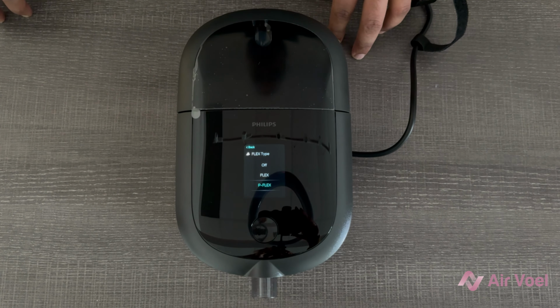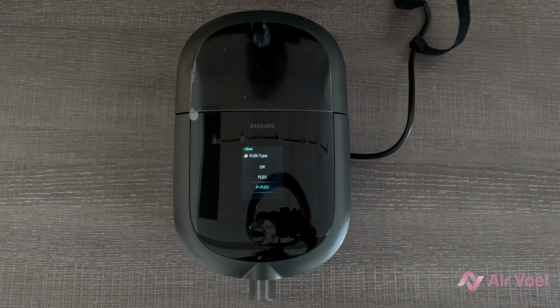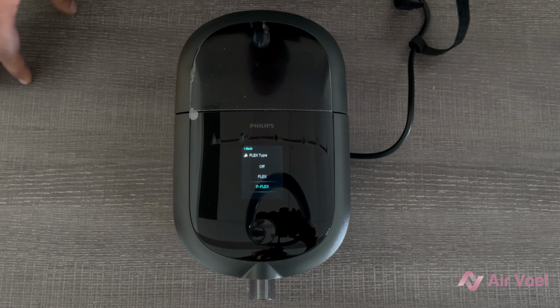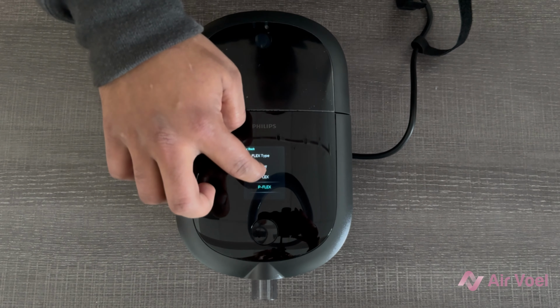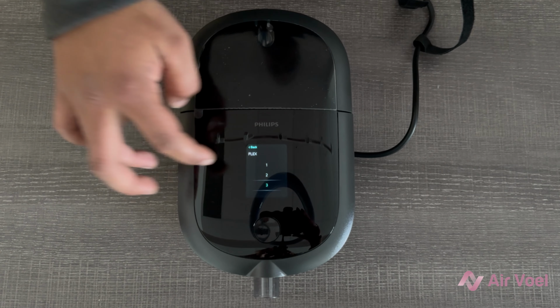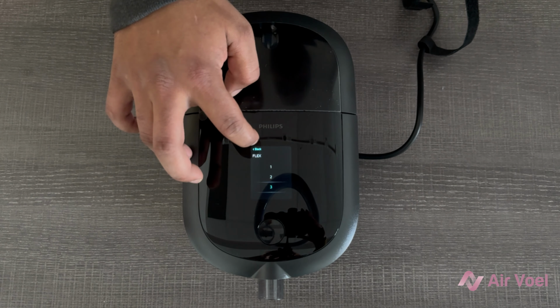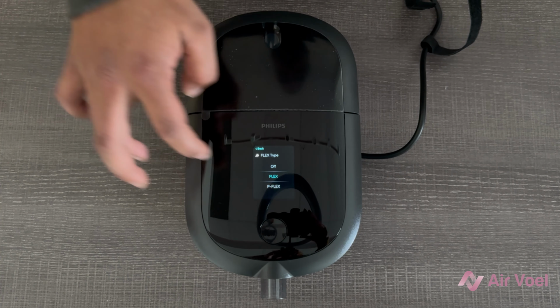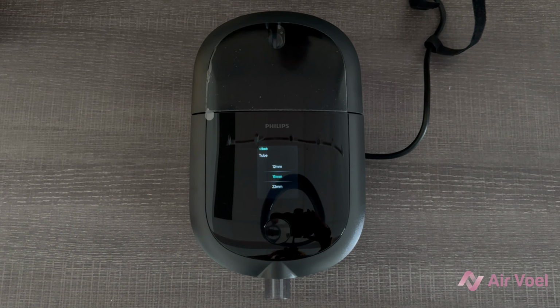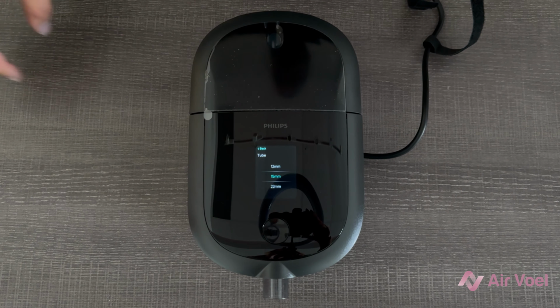The flex type is the setting for an exhale pressure relief, or a decrease in pressure for your exhalation phase. You can leave this off if your physician hasn't advised any pressure relief. You can keep flex on if you did want some pressure relief, and you can select a level of 1, 2, or 3. The higher the number, the more exhale relief you'll receive. There's also the proprietary P-Flex algorithm for the APAP mode of this device, which will auto-adjust your exhalation relief based on the pressure you're receiving.